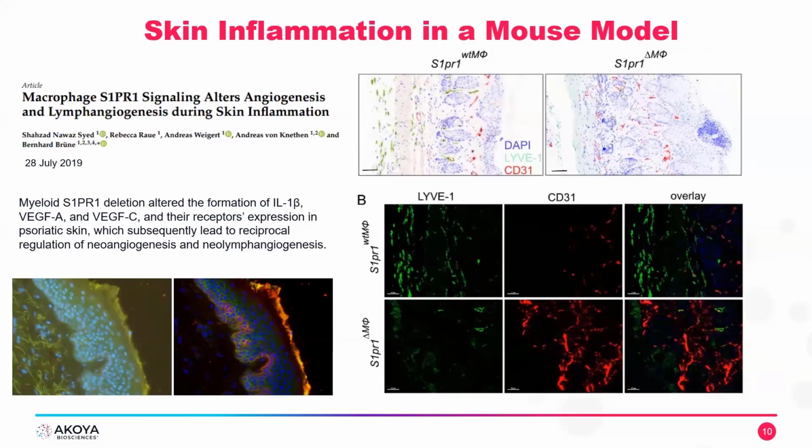And the multispectral technology is able to unmix and remove the autofluorescence, which gives you then much more reliable data here. On the bottom left, you see an example of skin tissue. This is actually not from the publication, but it illustrates nicely how the autofluorescence was removed from the skin, as you see then on the right side of the left panel.